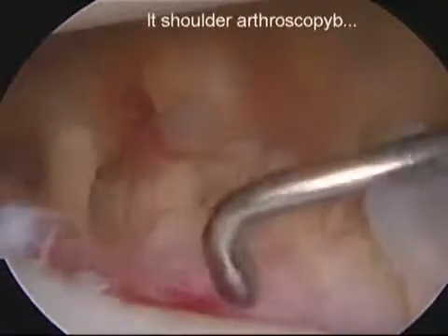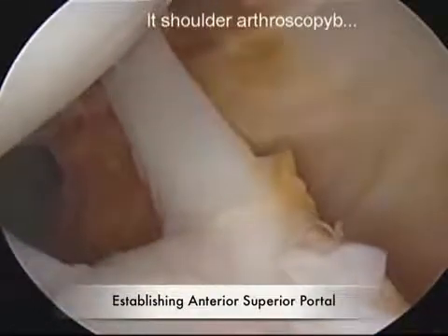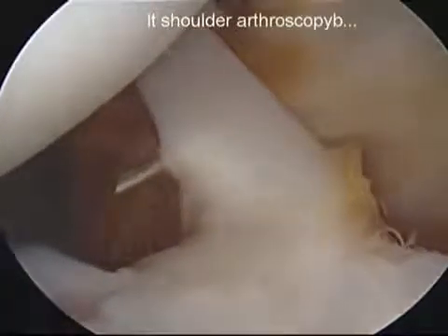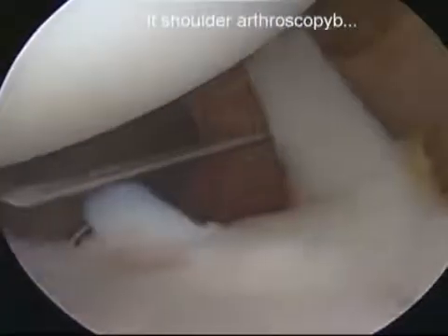An anterior superior portal is created in a similar fashion by palpating the anterior edge of the supraspinatus and utilizing a spinal needle to confirm appropriate access to the inferior aspect of the joint. This portal will be employed for viewing during the majority of the case.